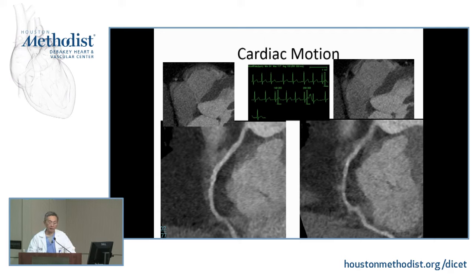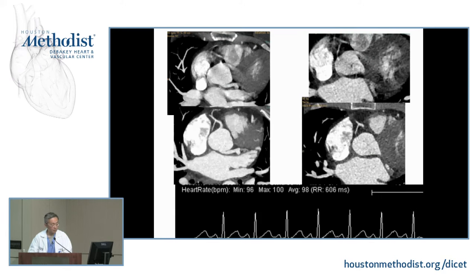from the previous R wave. You can choose to do systole. You can open the window for 100 milliseconds, 200 milliseconds, depending on the heart rate and the rhythm. So it's very important for you to know what the patient's heart rate and rhythm are to choose how much you want to open that window. You have to find the balance between the radiation exposure and the possibility of finding a good phase which allows you to see the coronary artery.